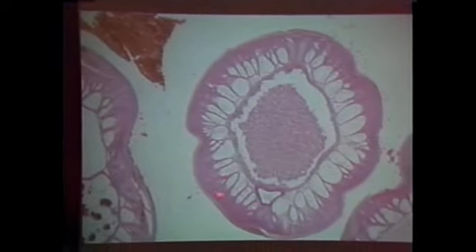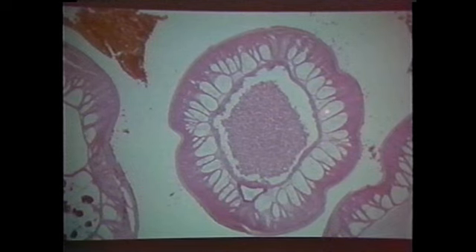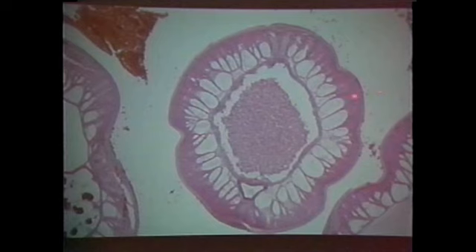Now, this looks different. Do you see all these muscle cells? This is coelomyarian. It's sticking to the inside like a column. All right? It too has cytoplasmic and contractile portions, and the contractile portions kind of come up the side of it, you see? Now this is important: do you see that the demarcation between the red contractile portion and the cytoplasmic portion is not smooth? People, this is what I mean by smooth. You see that? It's smooth. This is somewhat smooth, but this is really smooth. This is smooth, much different than that. That's your platymyarian. That's your coelomyarian.